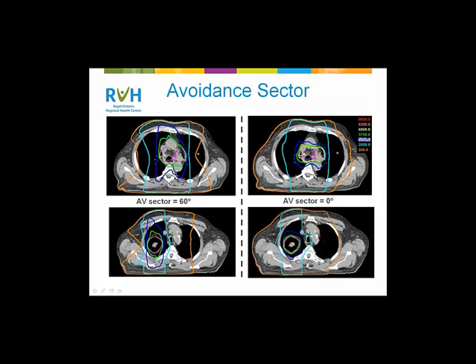Okay. What collimator rotation do you use for the RapidArc? We use 45 degrees for the collimator rotation. I'll be honest, I don't know what the right answer is for the collimator angle. What we did when we implemented this technique is we looked at 15, 30, and 45. Now, 45 gives you the best ability to optimize dose from a treatment planning perspective.